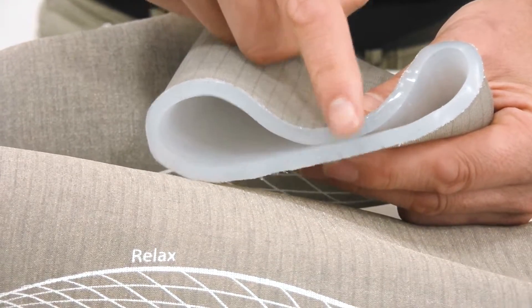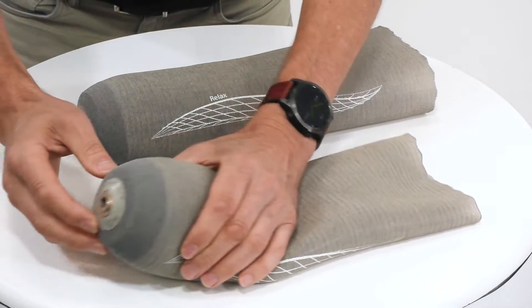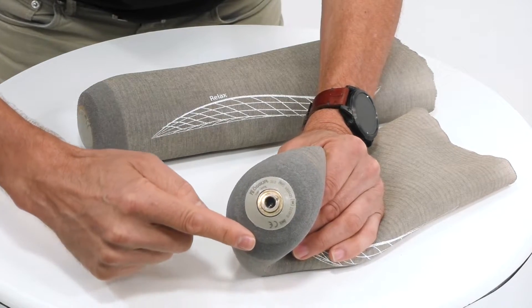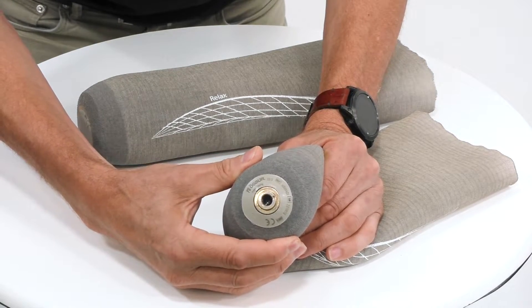Here you can see the silicon is much thicker. The locking liner is characterized by this distal connector into which we insert a pin that connects to a socket lock. We also have this size-specific umbrella, which helps manage and protect distal soft tissues.